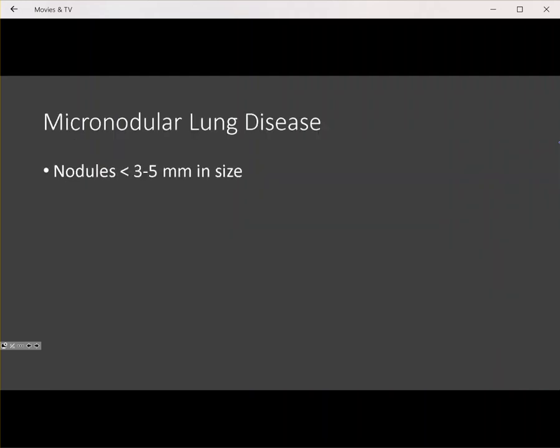So let's talk about micronodular lung disease. What is a micronodule? Micronodules are typically defined as being less than three to five millimeters in size — not sizeable nodules like seven or ten millimeters, but very tiny pulmonary nodules. For us to say that micronodular lung disease is present, it has to be numerous pulmonary nodules throughout the lungs, so that when you open up the chest CT your first impression is that there are multiple nodules — numerous and distributed throughout the lungs.